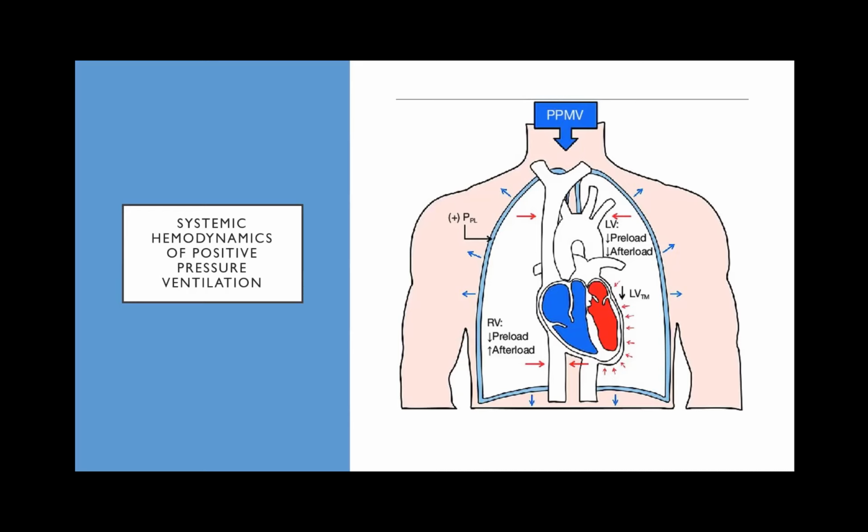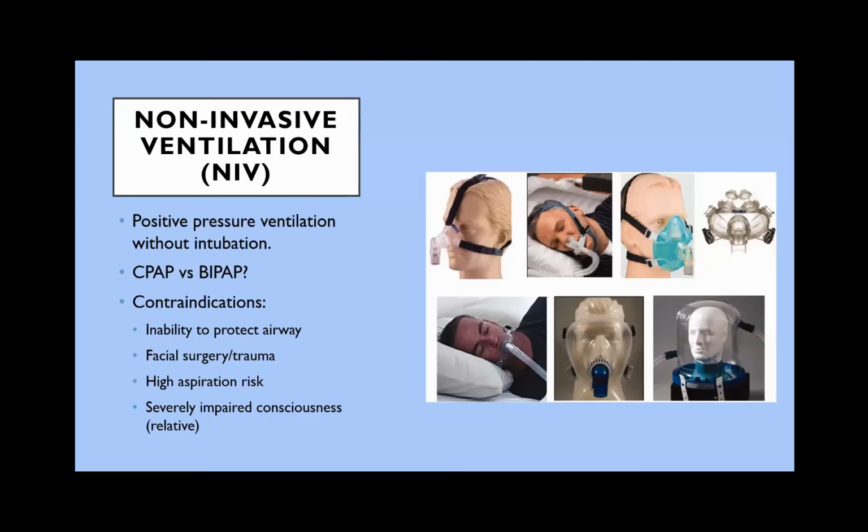So left ventricle, they love positive pressure. Right ventricle, they hate it. So always take into account that, because it's something you have to consider before initiating positive pressure in someone. Now, let's quickly talk about non-invasive mechanical ventilation. In general, this is positive pressure without intubation.